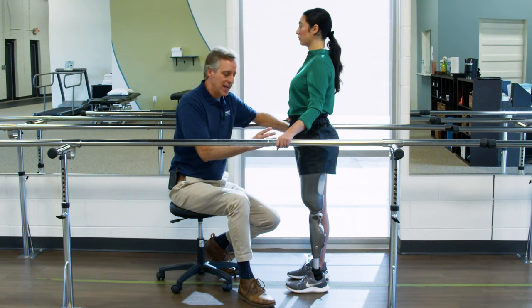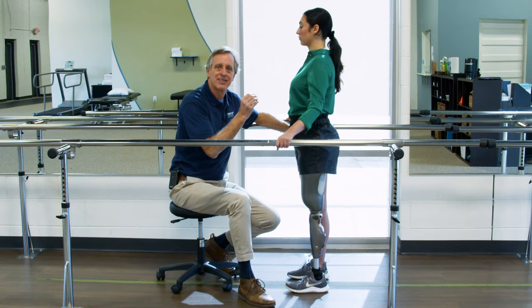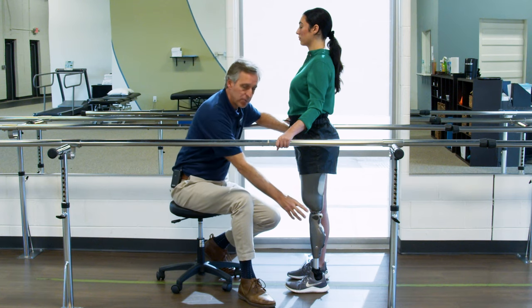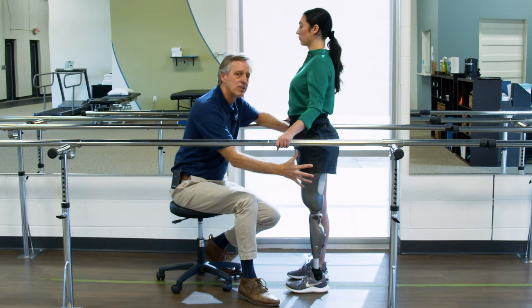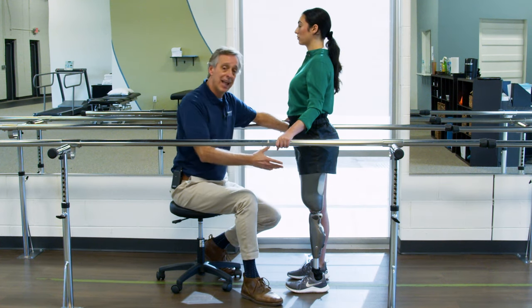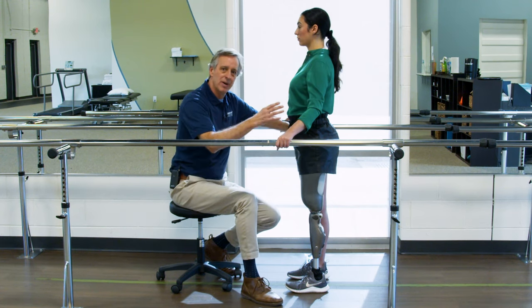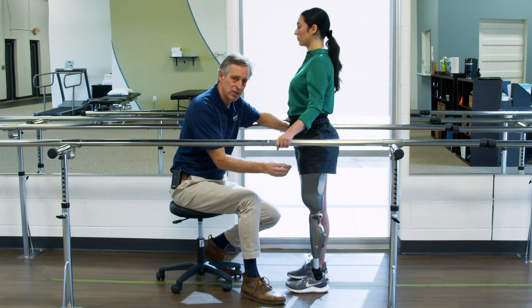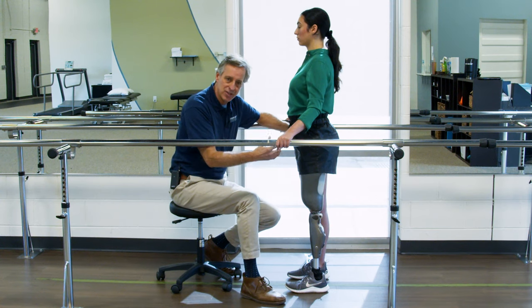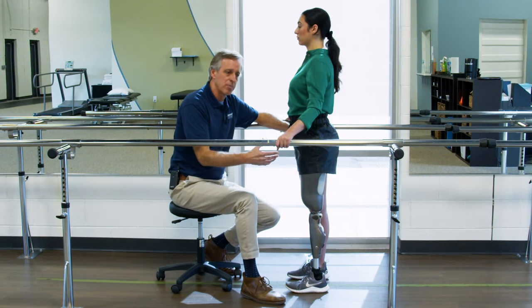No matter what technology we're working with, we are going to basically teach the person to walk the same way. I don't teach a microprocessor gait or a below-knee gait or an above-knee gait. We teach human gait mechanics, getting the technology to do the best we can. The same goes for age — eight years old to eighty years old, the same basic technique. You do make variations based on age or activity level, but the principles of the mechanics are the same.